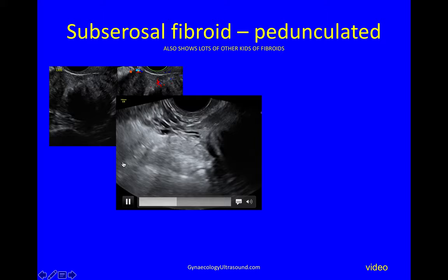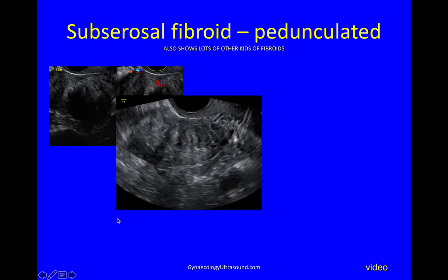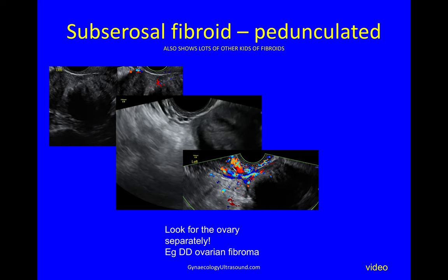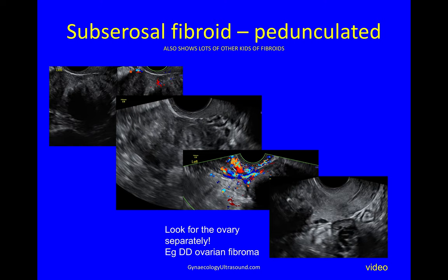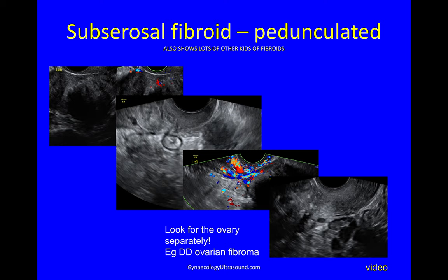This is a pedunculated subserosal fibroid — you can see the pedicle connecting the fibroid and the uterus, with all the other kinds of fibroids too and the endometrial cavity much distorted. If you put colour Doppler on the pedicle you can see that there's good flow, which proves it's a pedunculated fibroid, but you still need to show the ovaries separately to make sure it's not an ovarian fibroma. The ovary can be found much lower than expected but entirely separate from the adnexal mass.